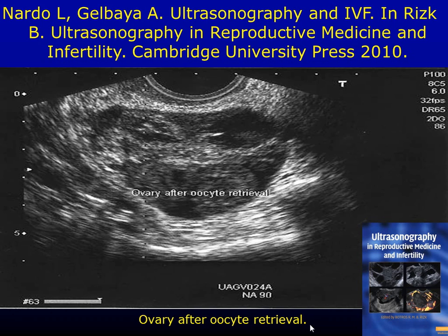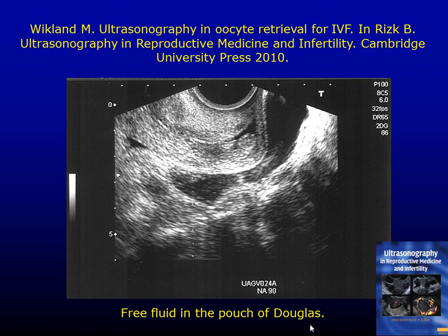So what is that? That is fluid and blood collecting in the space that was in the follicle. It will not disappear. I mean, it will not vanish. So this is the classic appearance 2 hours after the procedure and for the next 2 days. If you also look after the procedure, there is a small amount of fluid there. That amount of fluid is normal because the follicles had fluid, and you cannot puncture it and every drop will come out. Of course, excessive fluid implies either bleeding or hyperstimulation syndrome, as I will show you in a minute.